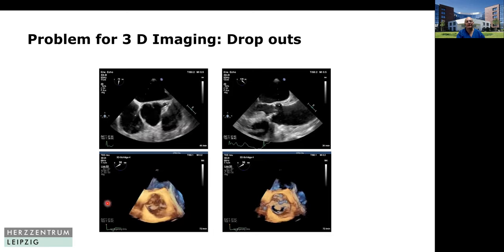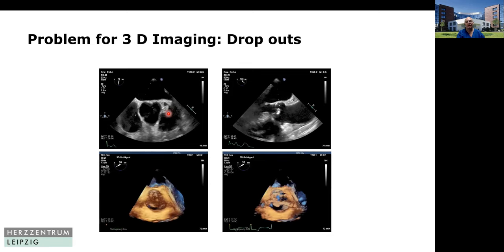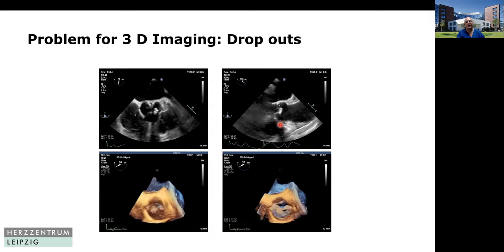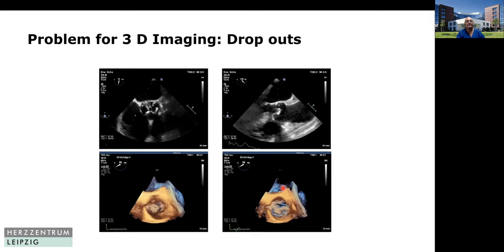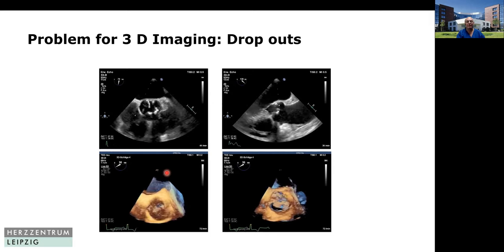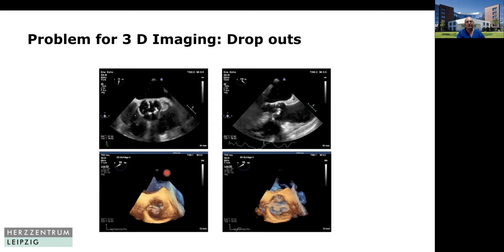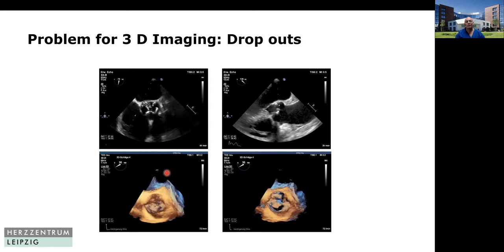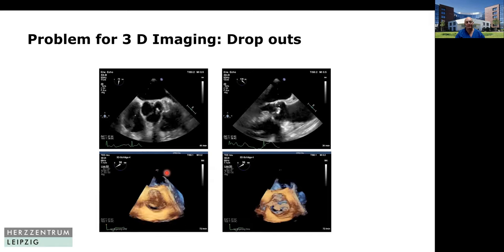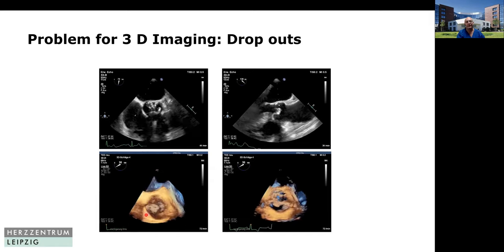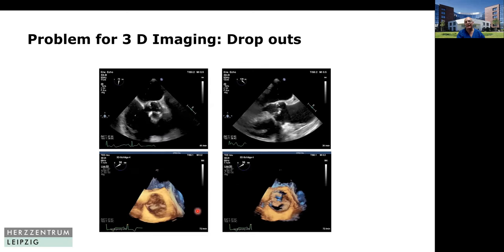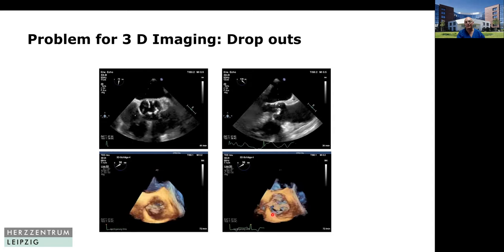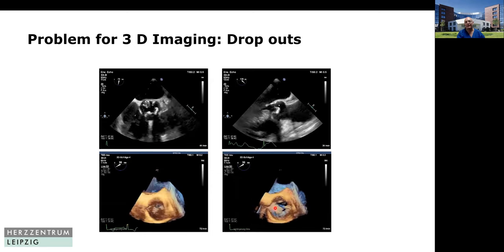Another problem for 3D imaging of the aortic valve is drop-outs — drop-outs due to calcification. The drop-outs in 2D, like shadowing, also appear in the long axis, and you have the drop-outs in 3D because 3D is based on 2D imaging. If the 2D image is not good or has drop-outs, then you will have drop-outs in 3D as well. In 3D imaging, if you increase the gain you hardly see anything. If you decrease the gain, like in this image, you see a lot of holes caused by drop-outs due to calcification.